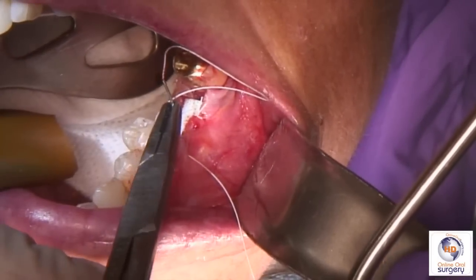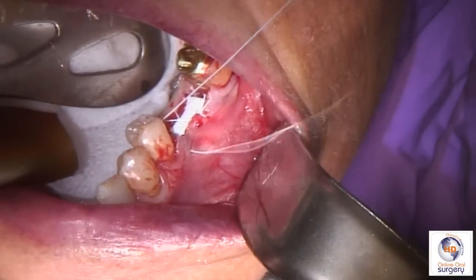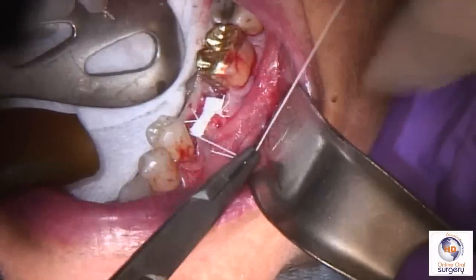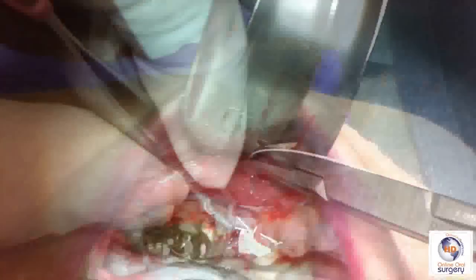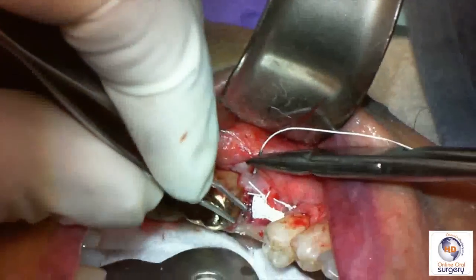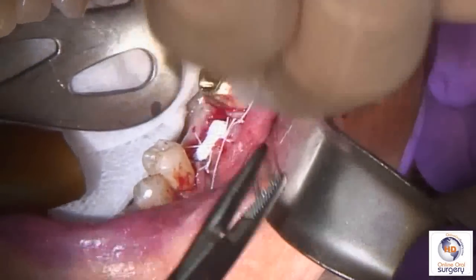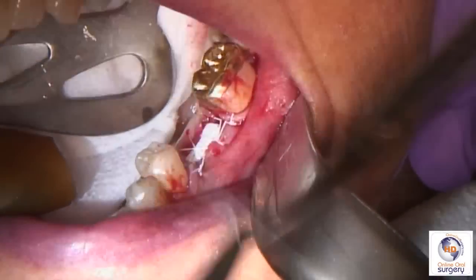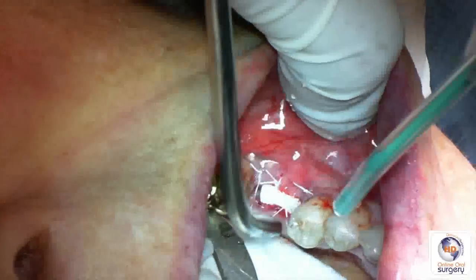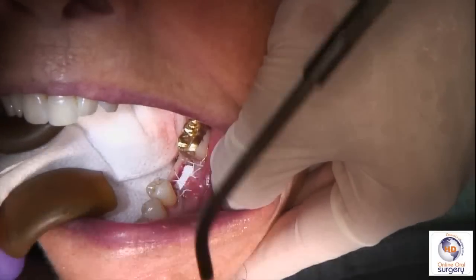Then we're going to go into the interdental papilla area on the mesial and do the same thing on the distal — just a simple interrupted suture in each of those areas. Again, because the suture has a little memory and tends to unravel, we're going to put an extra throw into it. So there we've sutured on the mesial and now we're going to do the same thing on the distal to hold the interdental papillas in place. As you can see, the tissue comes together very nicely — by elevating our flaps we're actually bringing the attached mucosa just a little bit more coronally.